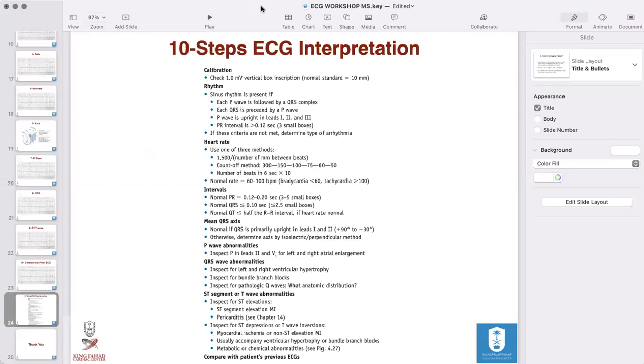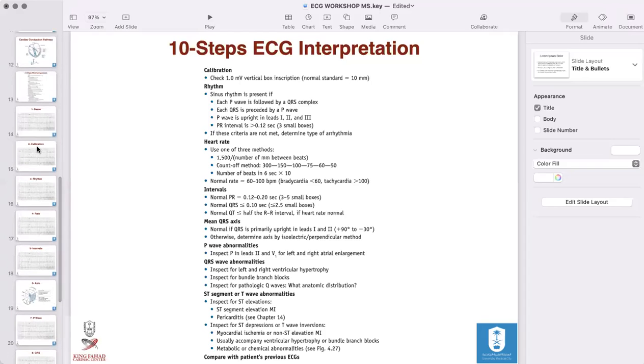Doctor. Yes. Yeah, about the axis, we just go with the thumb rule. That's it. We don't need to calculate with the other method. You can, but I want to simplify it for you, so it's not important. It is important later on, but at the beginning of your career in interpretation, I want you to develop the habits. Then with time, you're gonna deep dive into each one. I'm really simplifying it as much as possible.